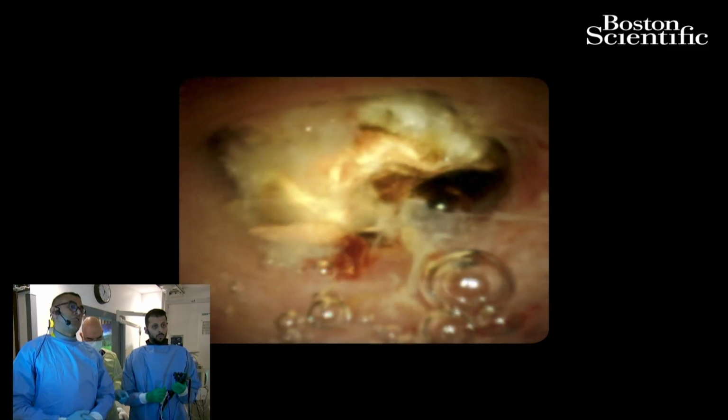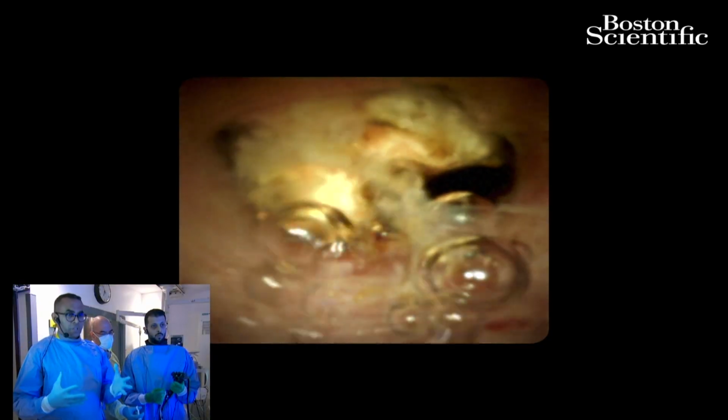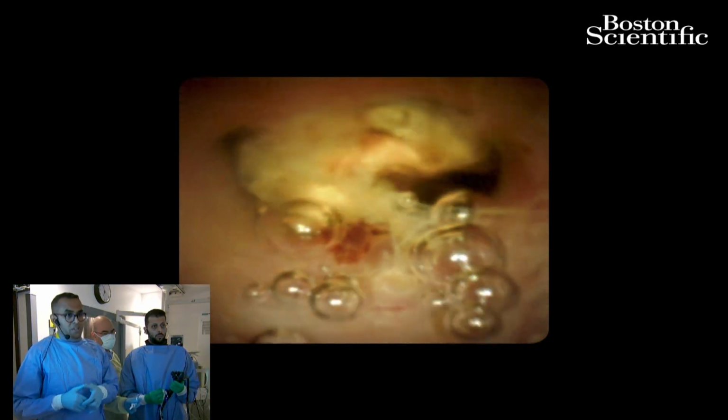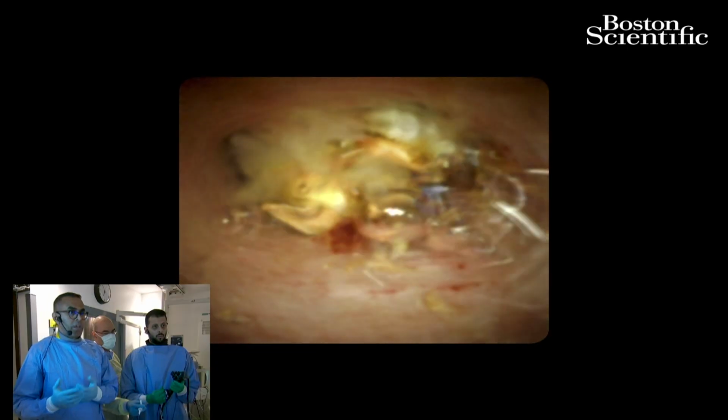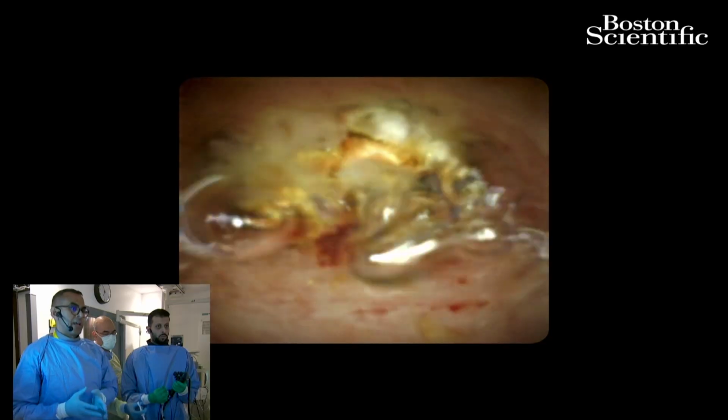So I can completely justify jumping in at that stage and putting in a spyglass to take biopsies and determine if this is malignant or not. Spyglass or cholangioscope can help in two different ways. Number one, the way it looks. Number two, tissue acquisition, which can be helpful in increasing the diagnostic yield.